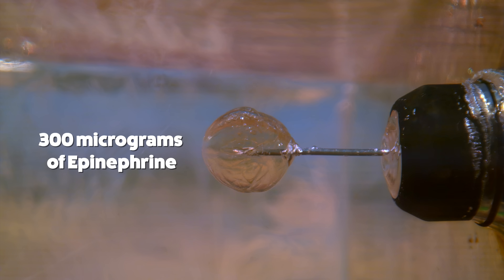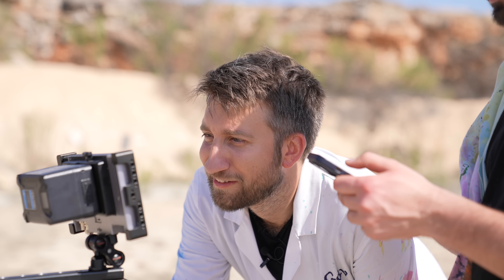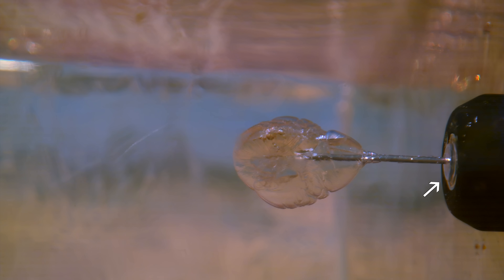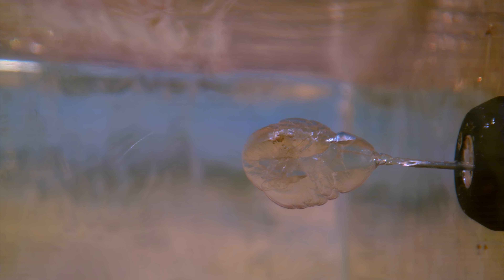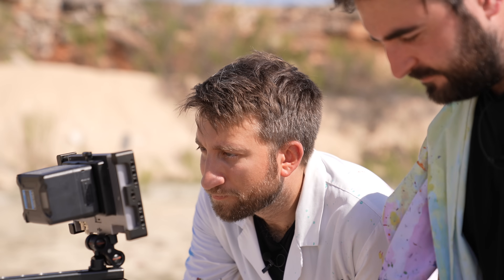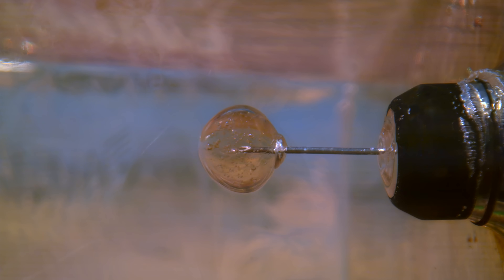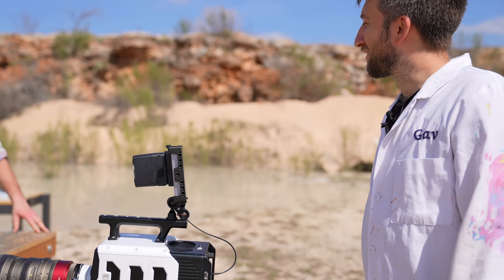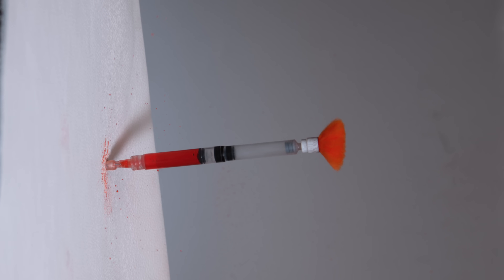If you need something right this second, just go — that'll save your life. That little bit of juice in there can save someone's life. It retracts too — when the pressure is released, it just sucks back in for safety reasons, so you don't twist it in your leg or whatever. See, it's pulling back in now — it goes and then comes back. It is instant; it doesn't mess about. It's not as big and epic compared to a lot of stuff we do, but that's really interesting. It's kind of like the tranq dart, isn't it?